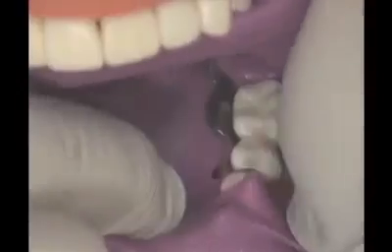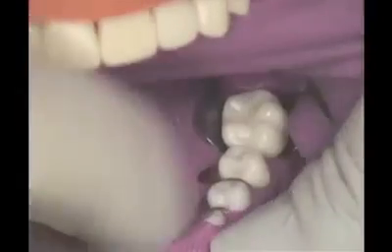Using your index fingers, stretch the dam on the lingual and facial surfaces of the teeth so that the dam slides through each contact area. With a piece of dental tape or waxed floss, floss through the contacts, pushing the dam below the proximal contacts of each tooth that is to be isolated. When removing floss, slide it through the contact facially rather than popping it back out. This will keep the dam in place.